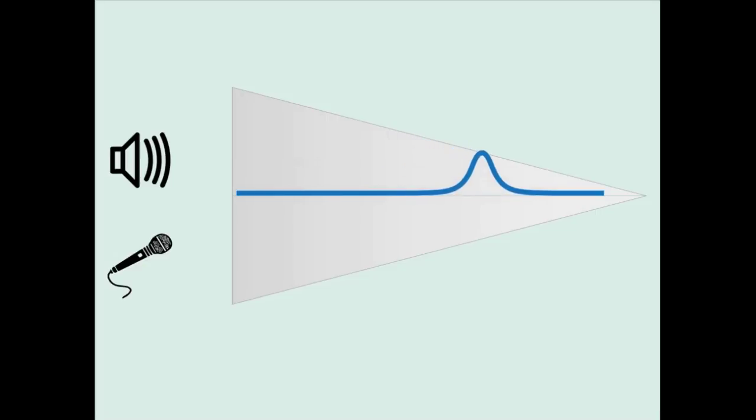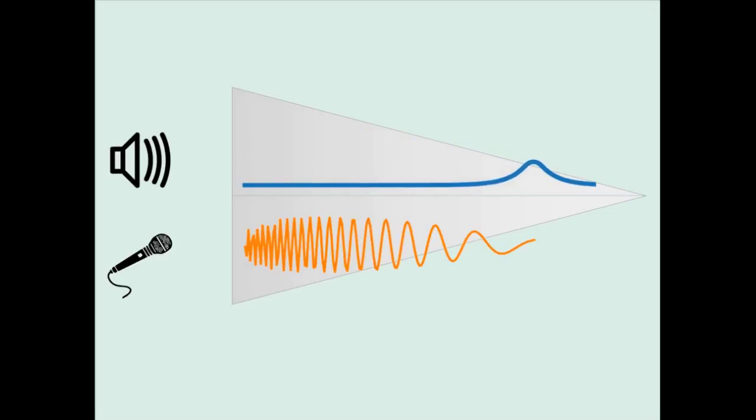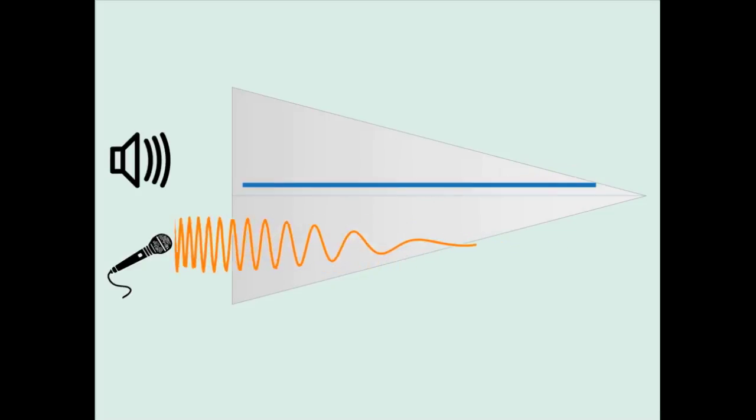And that frequency-specific nature of the cochlea in terms of adding energy, it also absorbs the energy. So we know that the high-frequency sounds cannot propagate beyond the basal end. So that's why the pulse shape is being modified as it travels along the membrane. But we also know that the energy that is being added is frequency-specific. So now we can look at what the energy added looks like. And so this is the response of the hair cells as that pulse moves along the cochlea.